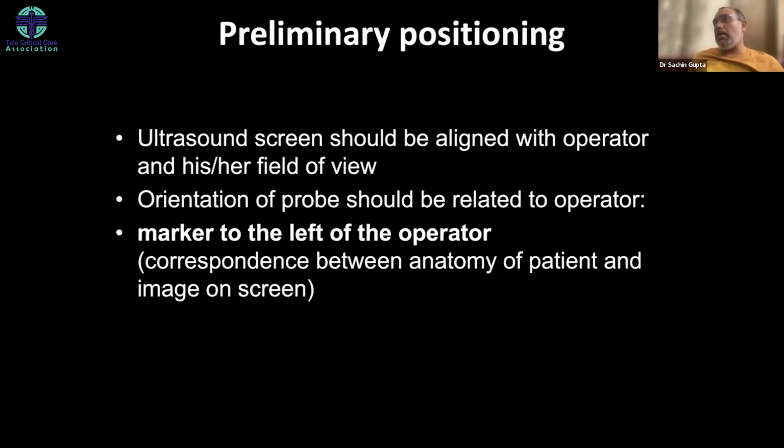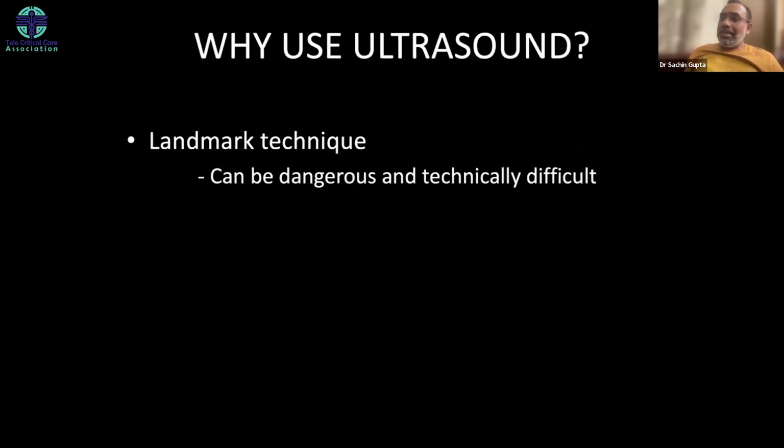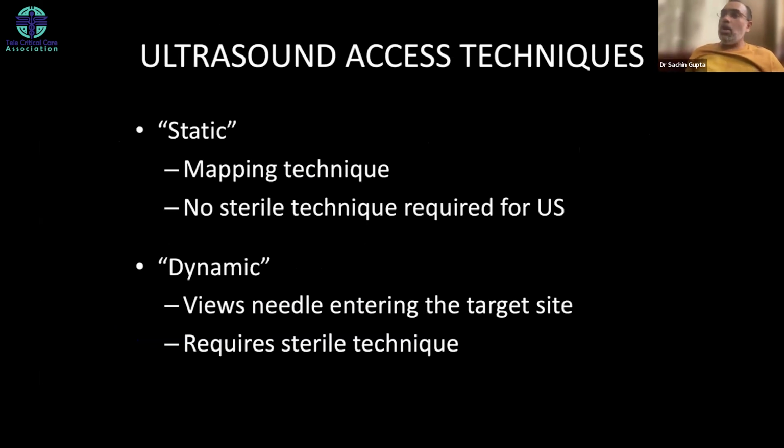As I said, marker positioning and orientation is very important, and this is crucial for the success of the procedure. The landmark technique, which is the classical technique, is dangerous and technically difficult, and we always say do all procedures with the help of ultrasound. Static is the one I was talking about, where you have seen a vessel, you have marked something, you have gone to wash, and then you have prepared that area in a sterile technique.